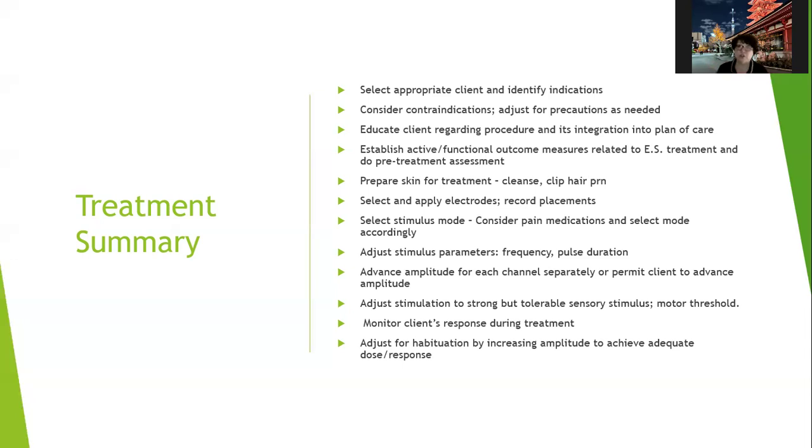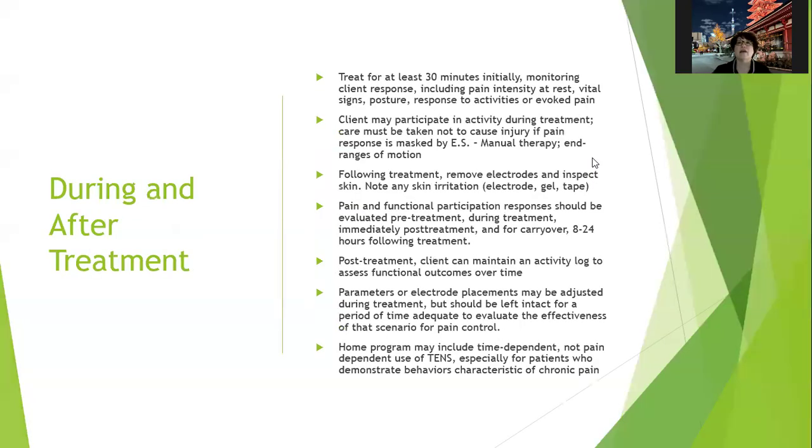You want to monitor their response during the treatment. You want to adjust for habituation by increasing the amplitude to achieve an adequate dose response relationship. And so during and after the treatment, you want to treat for at least 30 minutes initially, monitoring their response, including pain intensity at rest, vital signs, posture, response to activities, or whether or not the treatment evokes pain.